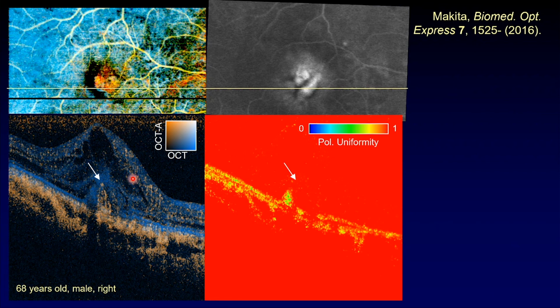There is a hyperscattering cluster, and in the right part of that hyperscattering cluster, we have a blood vessel. It's abnormal. In addition, at this point, we don't have a melanin signature, but in the left part of this abnormal hyperscattering, we have an accumulation of melanin. That is something we are observing.